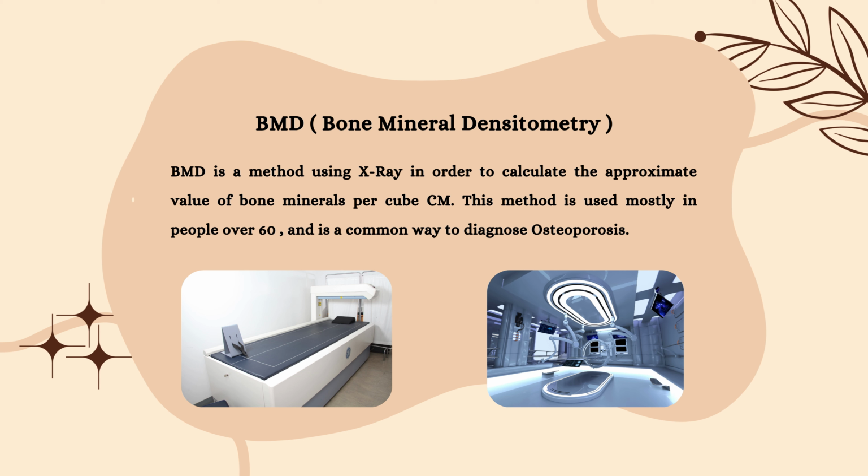Next, BMD, or bone mineral densitometry. BMD is a method using X-ray in order to calculate the approximate value of bone minerals per cubic centimeter. This method is used mostly in people over 60, and is a common way to diagnose osteoporosis.